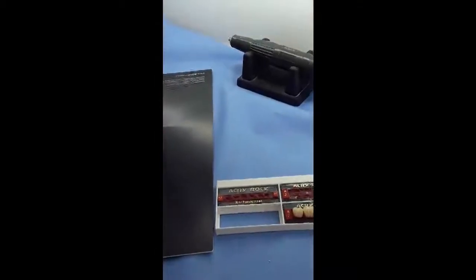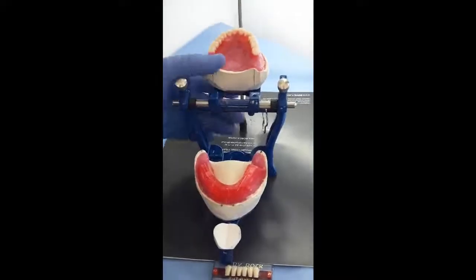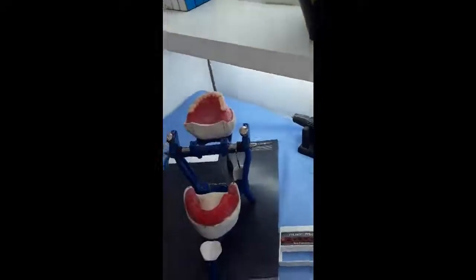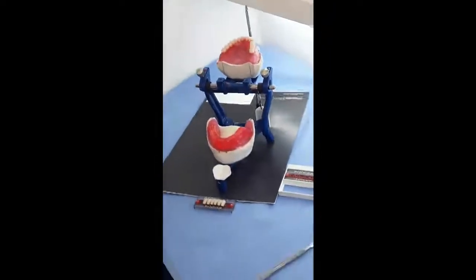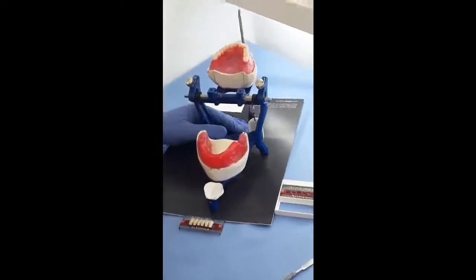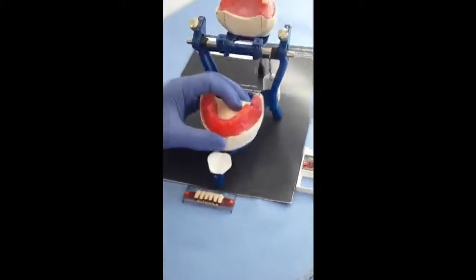Now we are going to remove a piece of wax from the lower wax rim at the midline, so it will accommodate the central mandibular incisor.